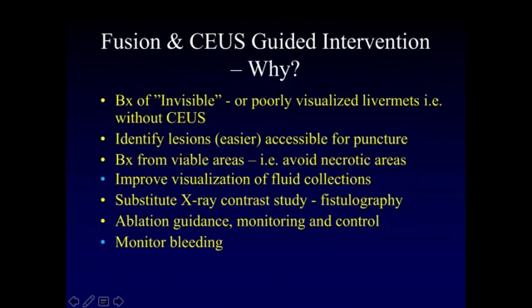I will talk about CEUS for guided intervention, but I will also include fusion, because what I will share with you is my daily work, and the work I do is a practical kind of work. So I use CEUS, but I also use fusion. And for practical reasons, you can talk about different indications for using these gadgets in our new interventional box.